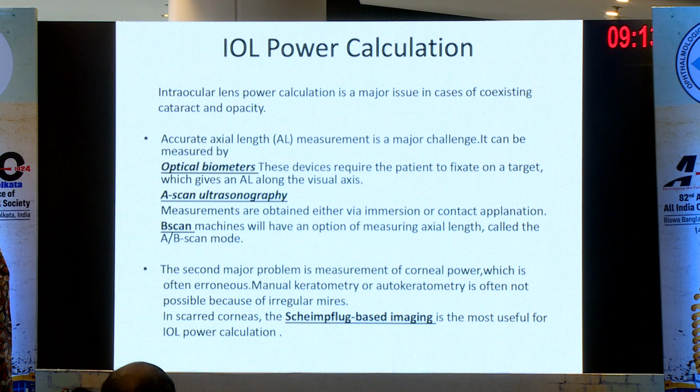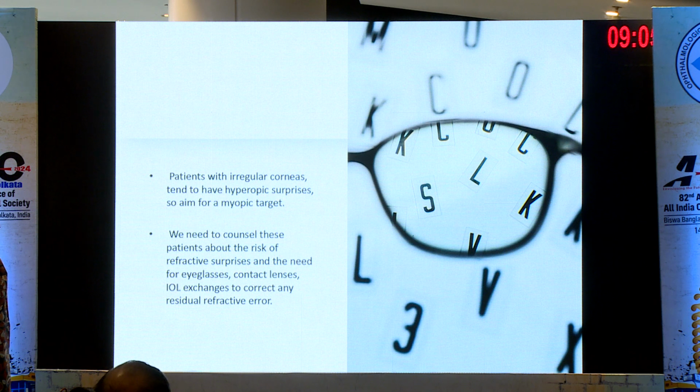So one has to resort to Pentacam imaging for these challenging cases. Patients with irregular corneas do tend to have hyperopic surprises, so one should err on the side of myopia. And one needs to counsel these patients about the risk of refractive surprises and the need for glasses, contact lens wear, or even a surprise which can result in IOL exchange in such scenarios.